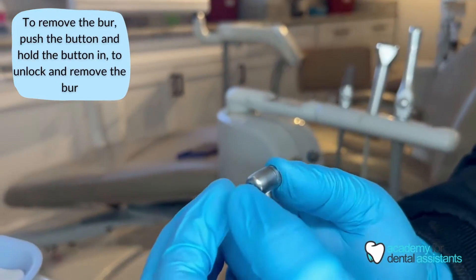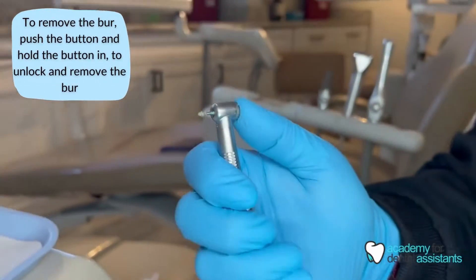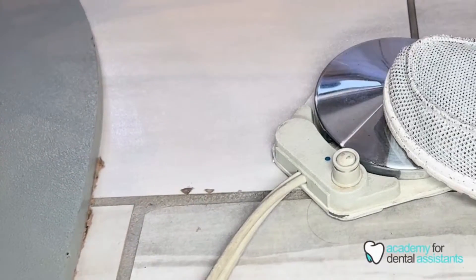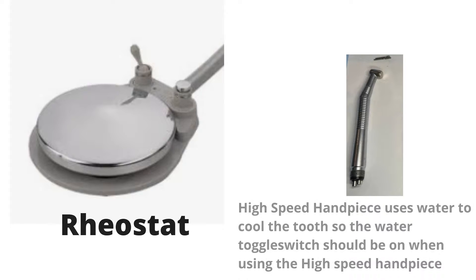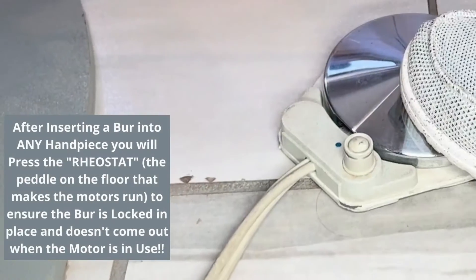To remove the burr, you push in the button on the back of the high-speed, which unlocks it, and pull out the burr. The rheostat is the pedal on the floor — that is what is pressed to make the motors go. After the assistant inserts the burr into the handpiece for the dentist, you always want to press the rheostat to make sure the burr is locked in place.